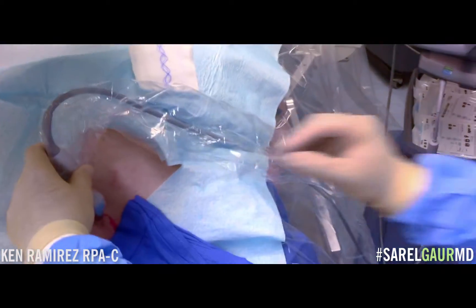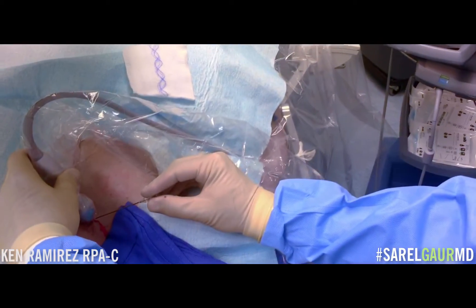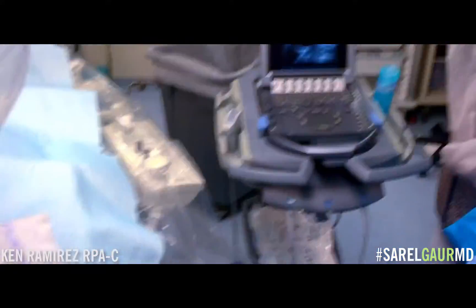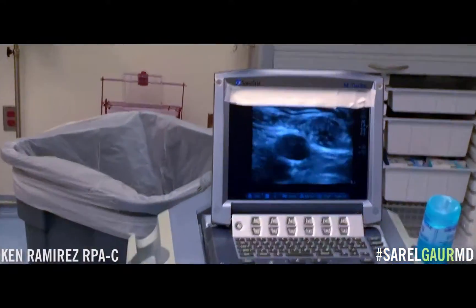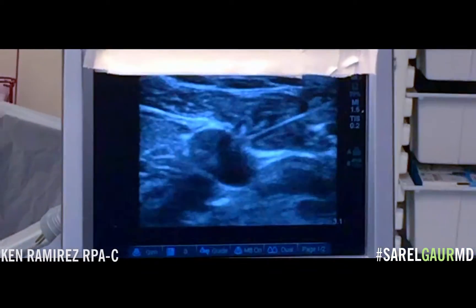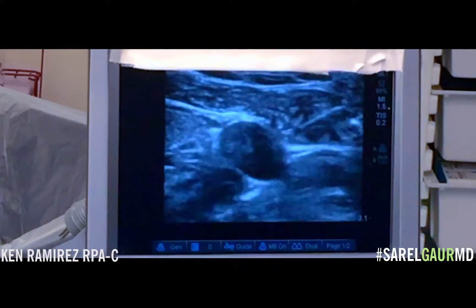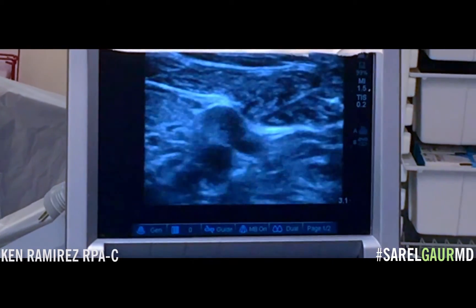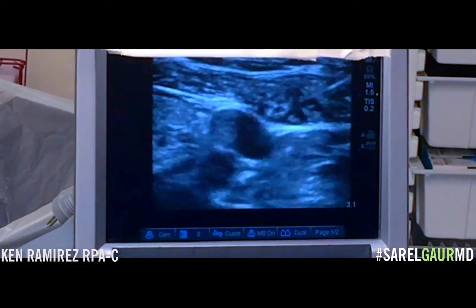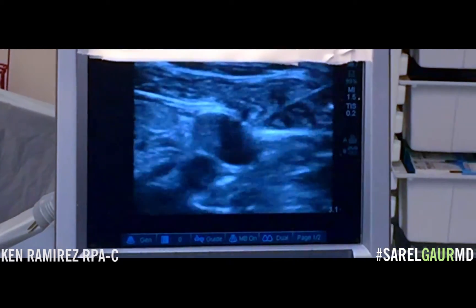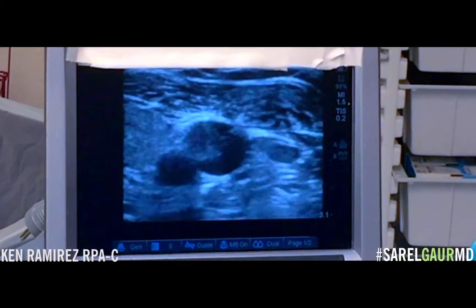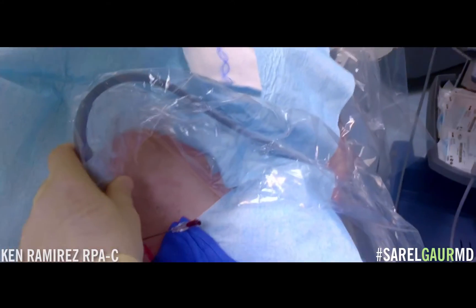So there's the needle, and I'm going to go into the incision I made. You can see the needle going in. And there it is — you can see the tip a bit.